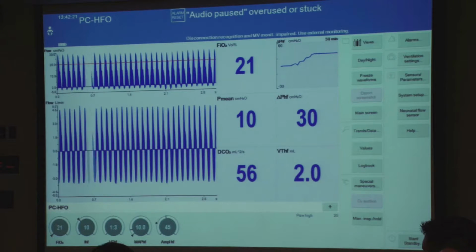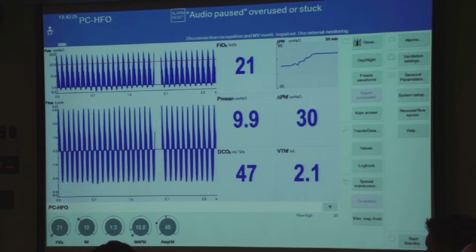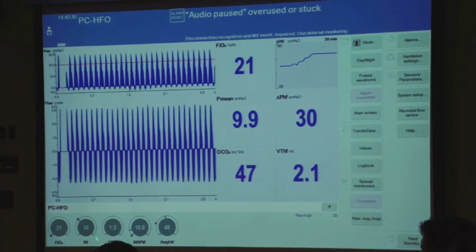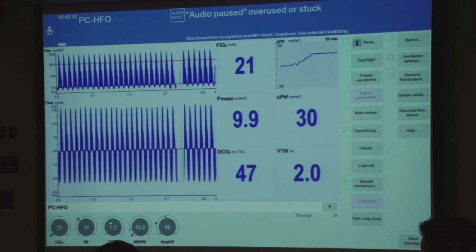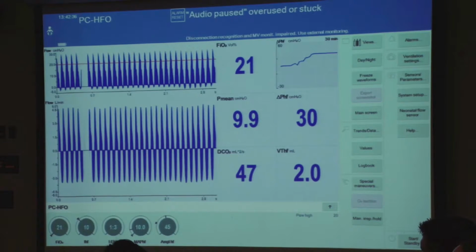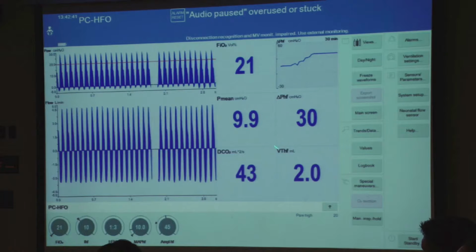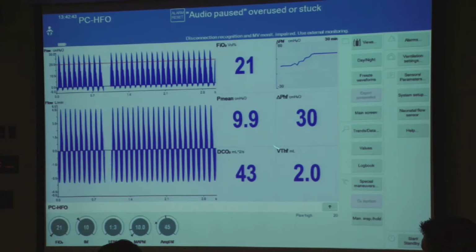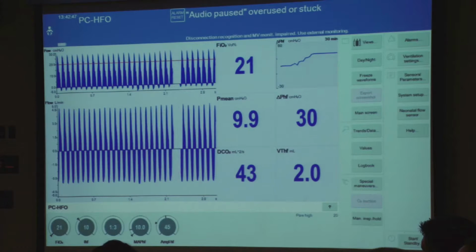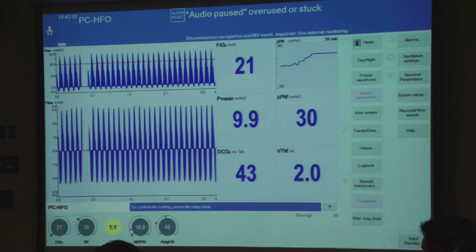But I just want to show you the relationship. There is a relationship between IE ratio and VTHF. When you make it even 1 to 3, and that would be in a SensorMedics 0.25, which I don't think you can dial in a SensorMedics, you will lower the delta P and, by definition, lower the VTHF. What happens if we go to 1:1?